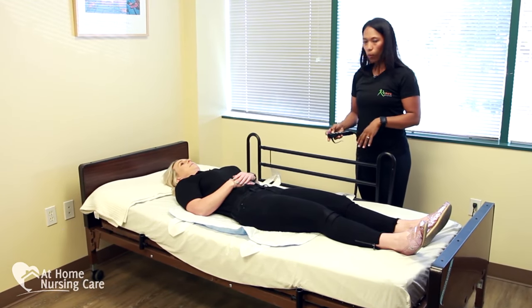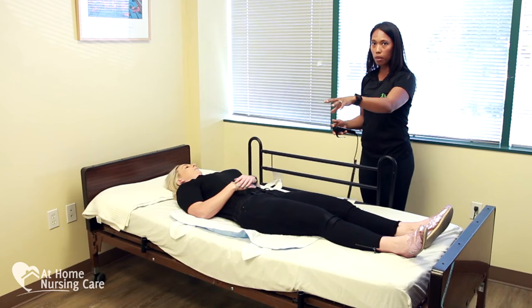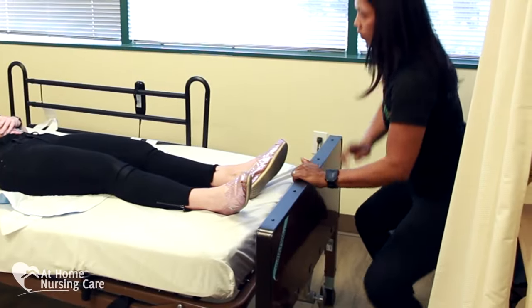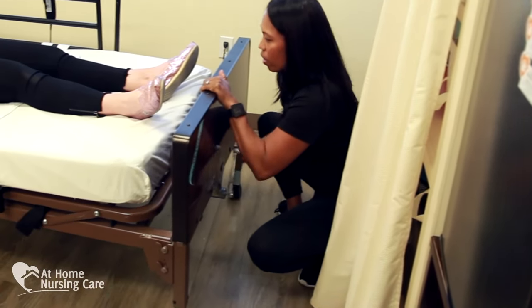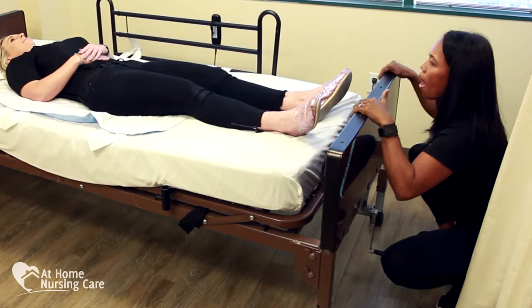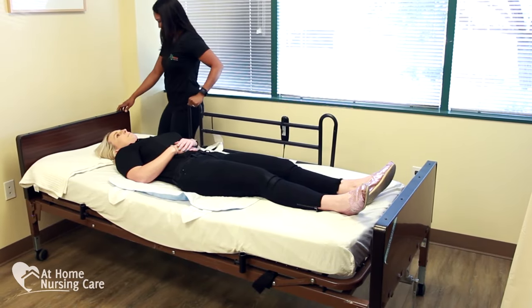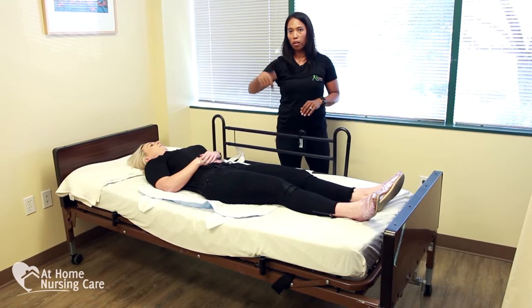Once she's flat, we also want to create a good working environment, so we adjust the bed up — the last thing we want to do is round out our back while helping our clients. This bed is a manual lift, so we're going to raise it up manually. Most beds also have an electric button to raise the bed. After you have a good optimal position, make sure you lock the bed into place — the wheel locks are usually on one side, front and back. I have the side rail up on one side and down on the other to prepare to use the Hoyer Lift.